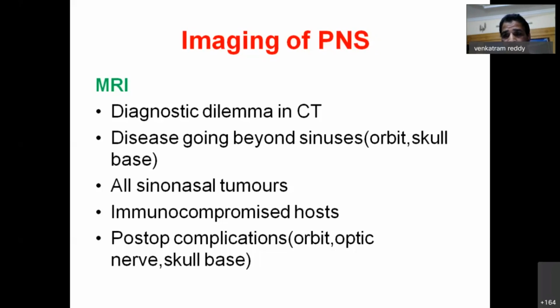sequences of more than 1,000 or 1,200 sequential images, sometimes fat suppression, and then different kinds of soft tissue images. So the sequences are many. You can get 500 sequences, 1,000 sequences, depending upon your requirement and the ability of the radiologist. So the MRI, for us as a basic for residents, is when to take MRI for a sinus evaluation or a skull base evaluation.